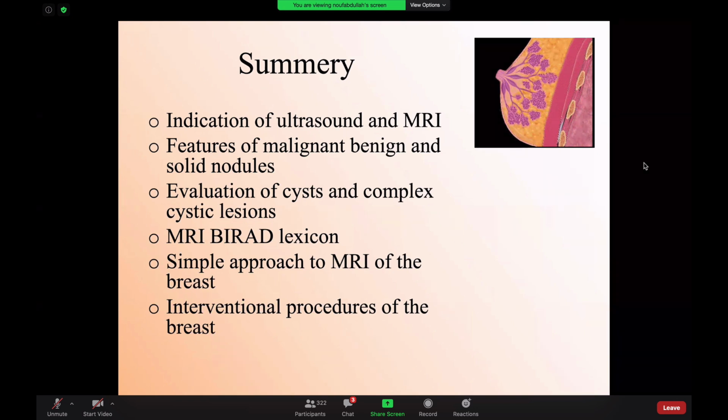We learned about the interventional procedure, guys. So you had to understand what is stereotactic guided biopsy. You learned about the 15 plus, 15 minus appearance. You learned that whenever you do stereotactic guided biopsy, you will take an X-ray of the specimen to be sure that there is microcalcification in the X-ray of the biopsy specimen. You learned that we always put a marker. You learned that once we finish the biopsy, we do a mammogram to be sure that the marker is located in a good location of the biopsy.